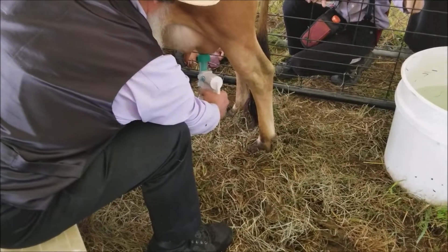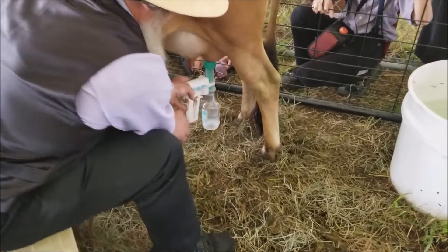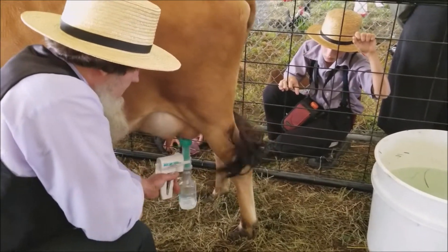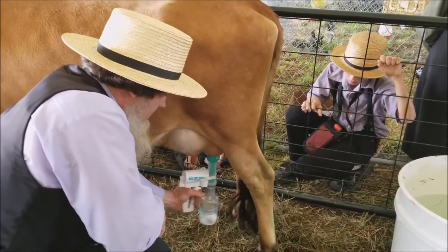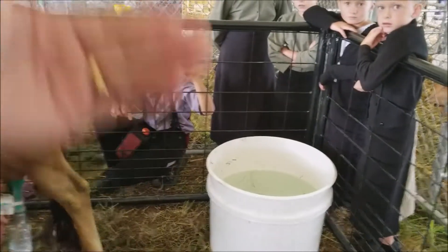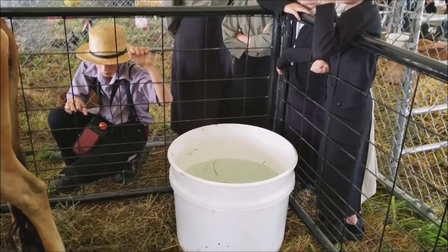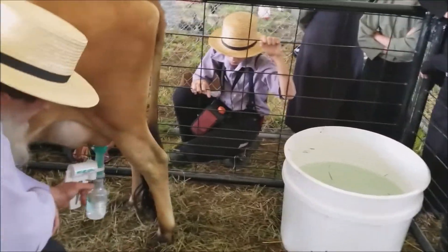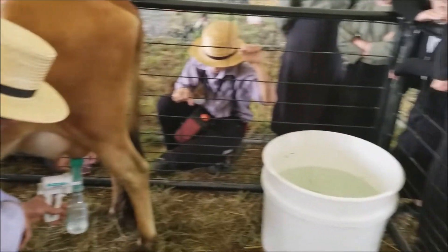We'll just have to bear with us for a little bit. Once you get that milk started, go ahead and give it a couple of pumps. Once you get the milk flow started, quit pumping — you don't have to sit there and keep pumping. As the vacuum goes down, give it two or three more pumps, you pick it back up, and that's the way it works.